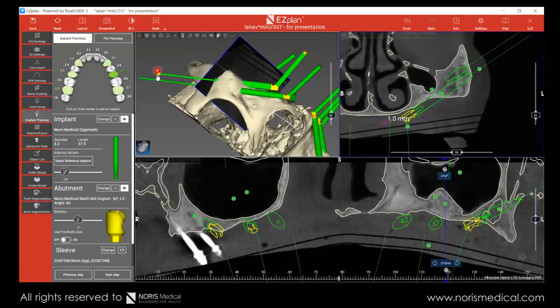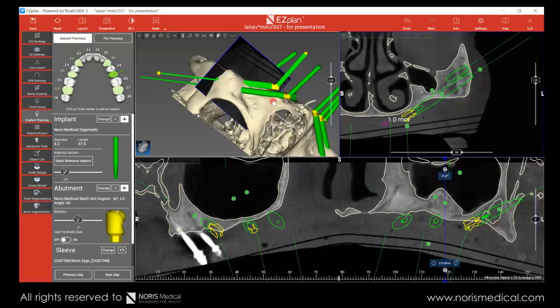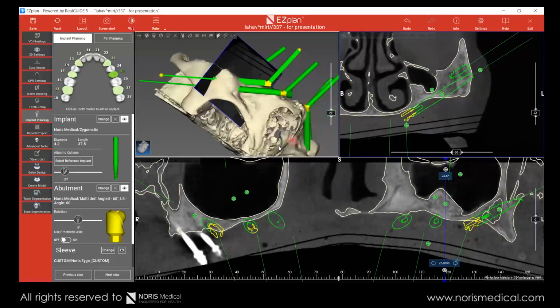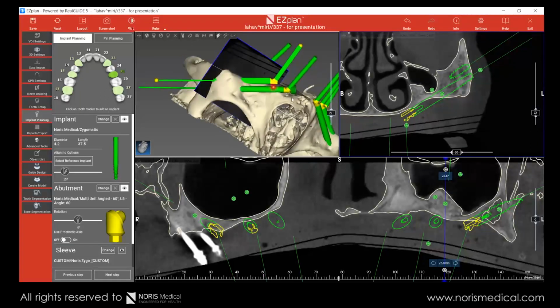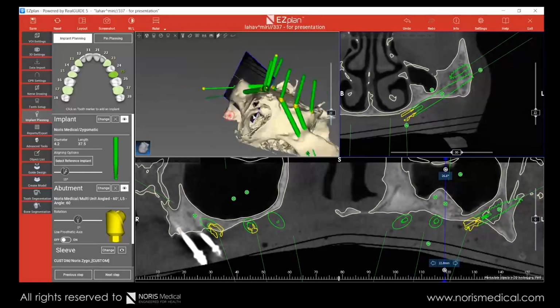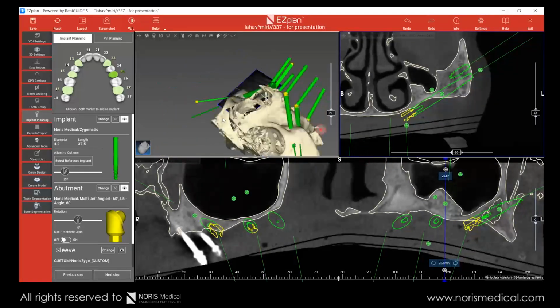I can lift it up a little more. I can either lift it up or I can take it down here, same thing. Taking down, same thing. I increase the distance here. Now I can lift it up a little bit, like that. And when I look from here, now I have more space, which is here. So this is a very, very important tool, the parallel view.